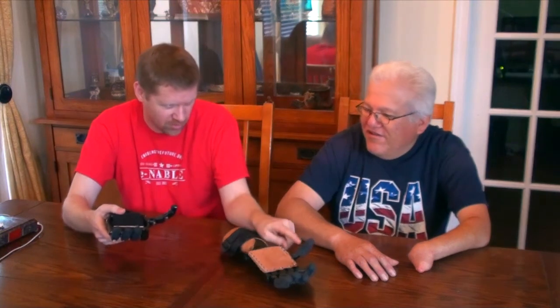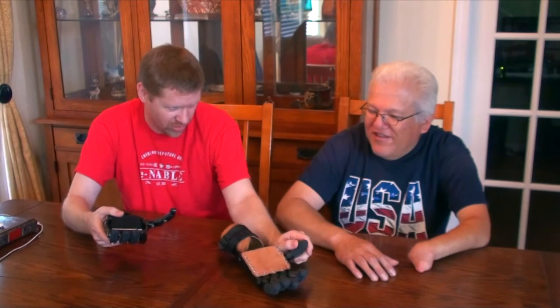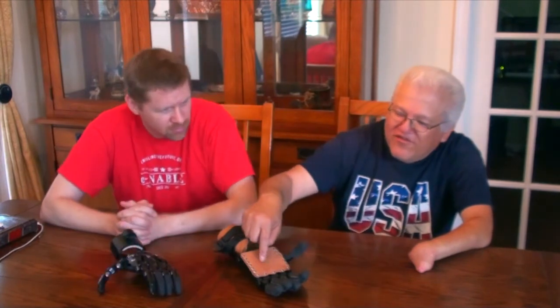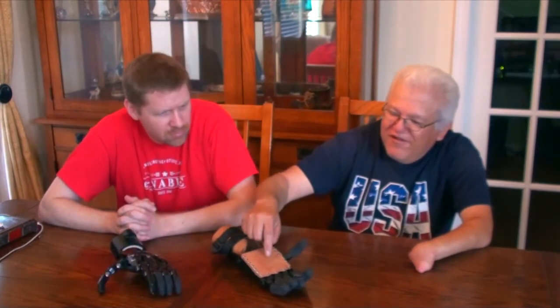They've got that stuff called Plasti-dip. Yeah, we used to use that — it's a little bit hard to work with, it gets kind of messy, and I don't know that it does as well as something nice and thick and rubbery like this. But that's another option. Maybe I could get something rubbery here to help with the grip. So some kind of rubber pad that's adhesive that we could stick on there, or we could screw it on.